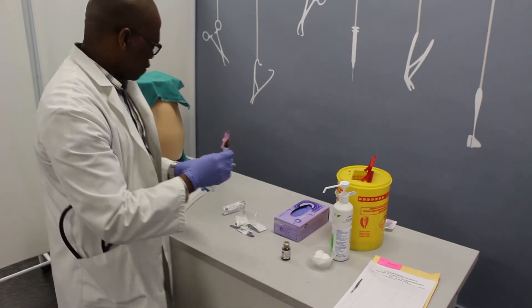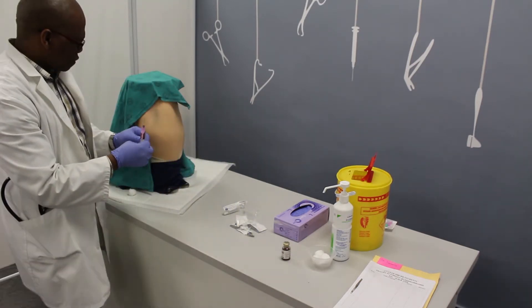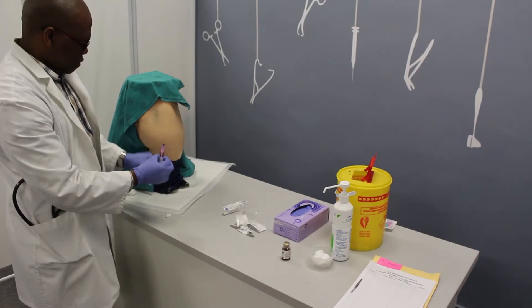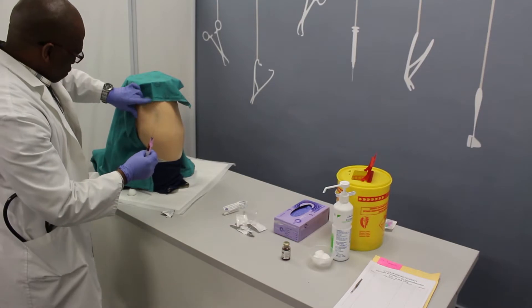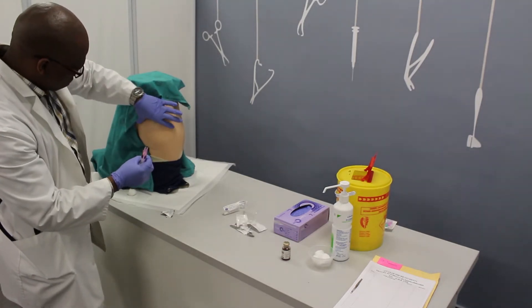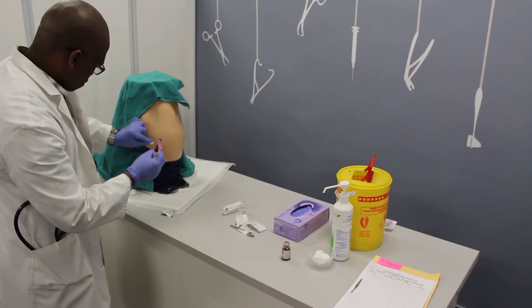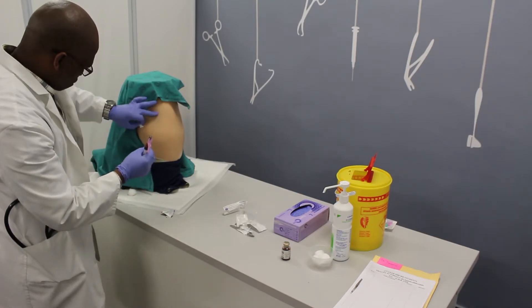On the patient, divide the dorsal gluteal region into four quadrants. This is to avoid injuring the patient's sciatic nerve, which could lead to serious complications. Clean the upper outer quadrant with the alcohol swab and let the site dry.